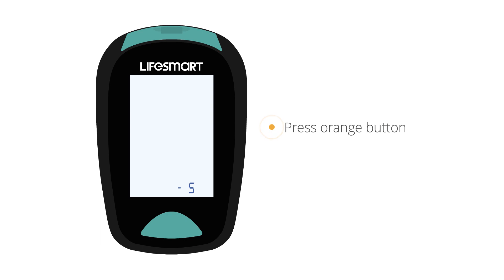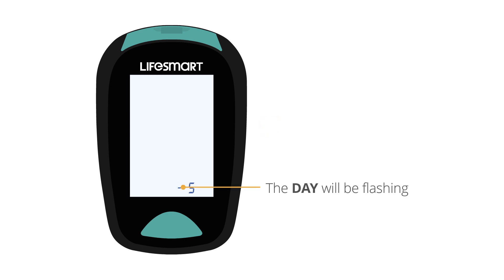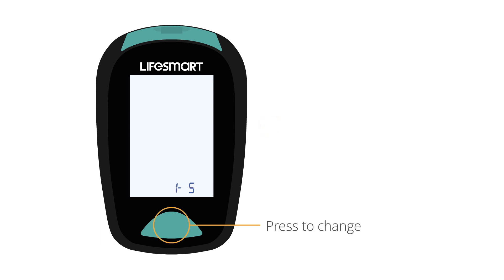Press the orange button again. The day will be flashing. Press the green button to change.